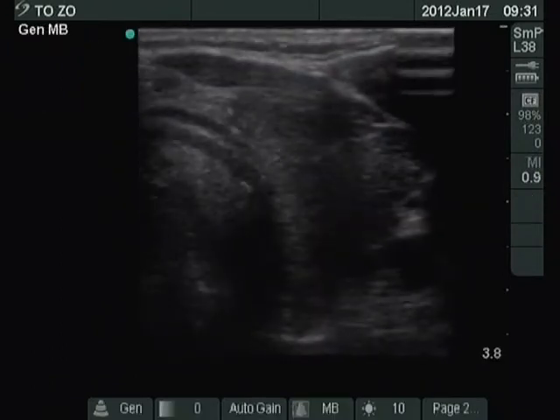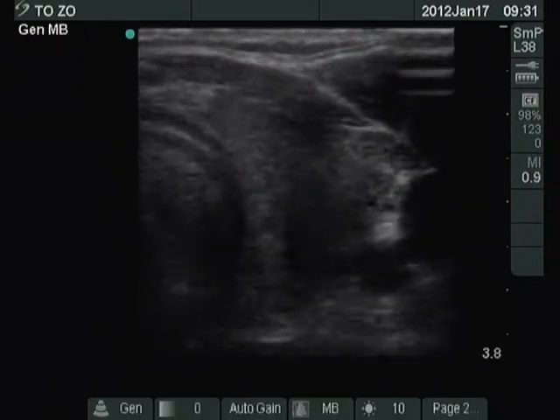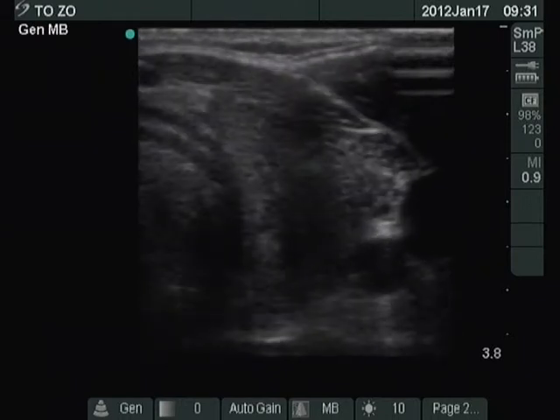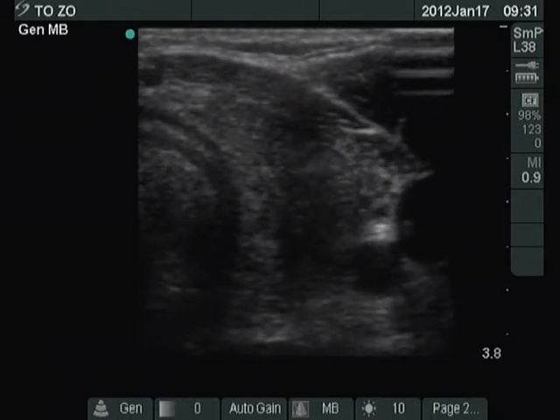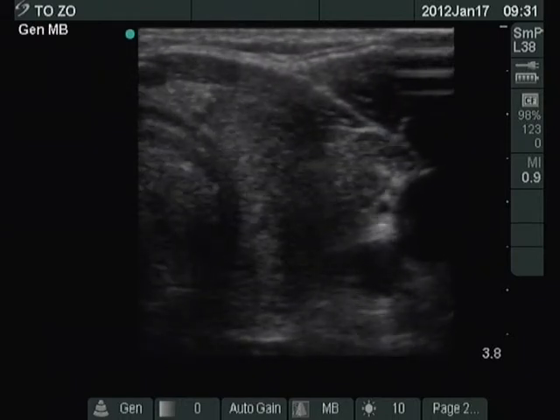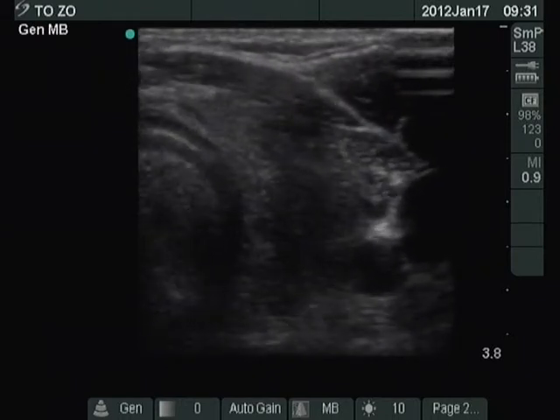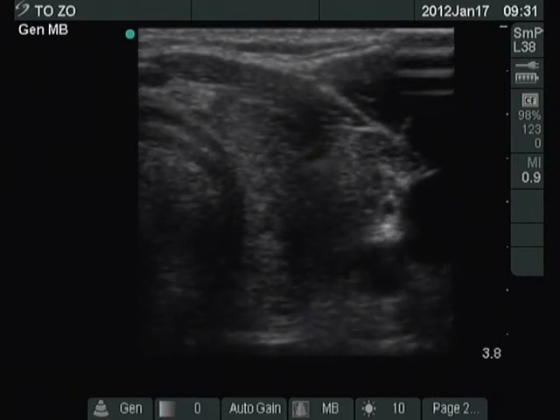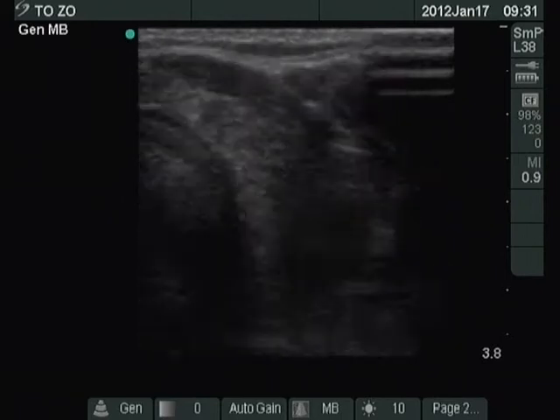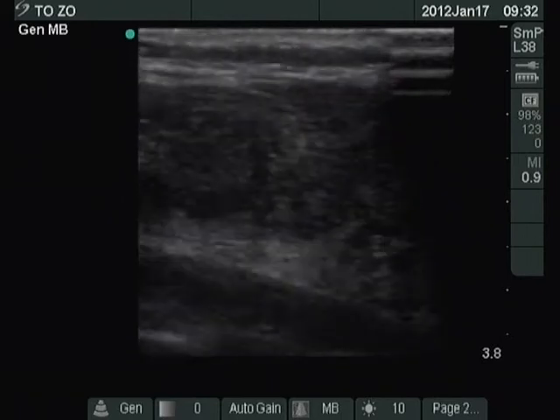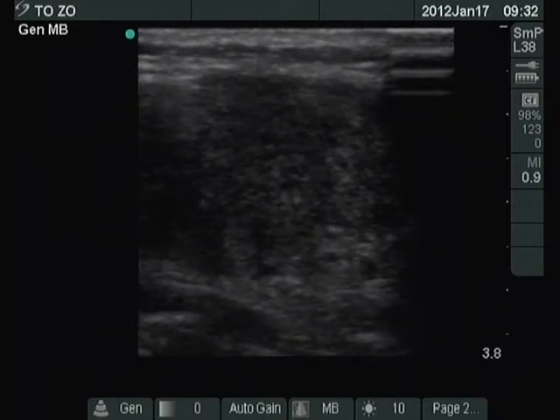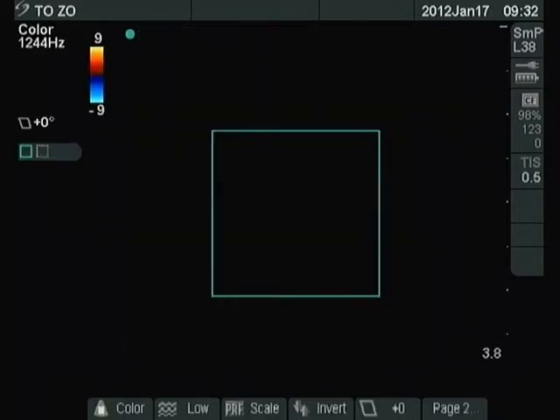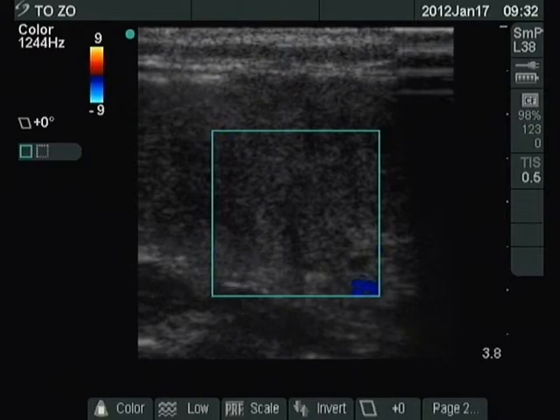The ultrasound properties are similar in the left thyroid; hypoechoic areas are present with blurred borders in an echoic background. This is the longitudinal view of the left lobe. The vascularization is absent.